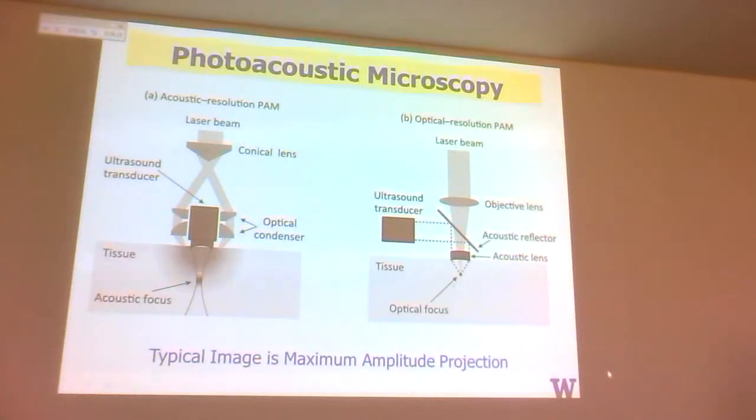Okay, so that's the how. So we've done 2 of the 3 major pieces of the way the world has worked. First is these low rep rate, high intensity lasers, imaging over large volumes, and that's done basically, and has really been optimized for small animal imaging.